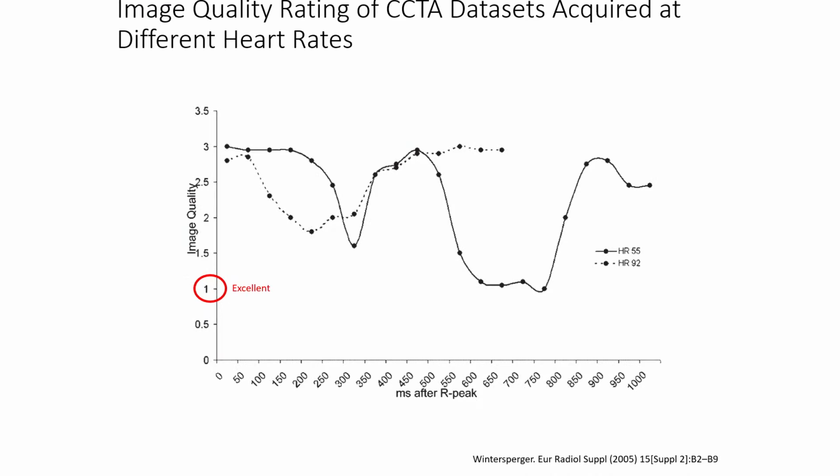All right, regarding image quality, as all the fellows know, the heart rate determines the image quality, because the heart rate determines the quiet period of the cardiac cycle, when the heart is not moving. That facilitates freezing the cardiac structure in order for you to image.